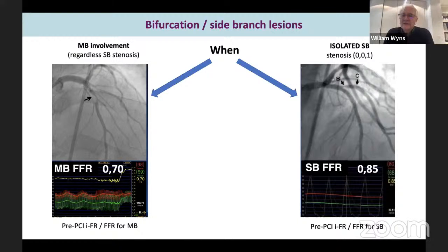Now, I love this case because it is one where you have clearly a mismatch between the apparent stenosis severity, at least in this view, and the functionality, which is preserved. And sometimes this irritates colleagues because they say, look, tight stenosis, and look at the FFR. And I think what the colleagues from the European Bifurcation Club have nicely shown is that you have these slit-like stenosis images that heavily depend on the projection. And the reason is that the cross-section of the ostium is not circular.